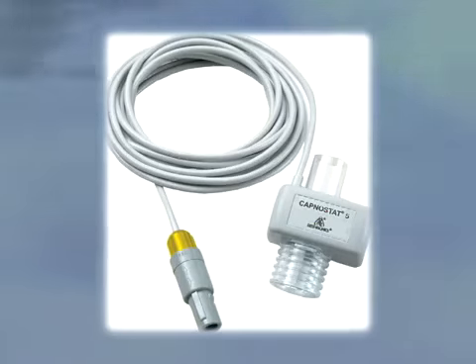Mainstream sensors have a very fast rise time, which allows the sensors to measure CO2 levels accurately in all patients, including neonates. Unlike older versions of mainstream sensors, today's mainstream sensors are small, lightweight, and run on very low power, which eliminates previous concerns that they were too heavy and would drain your monitor battery.